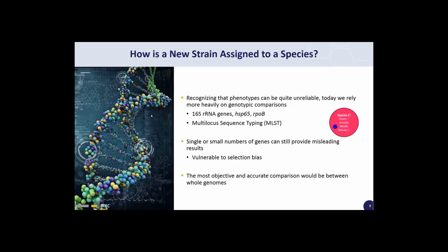If comparing this new nitrate-negative strain to the type strains we saw previously, it might be more tempting to categorize the new strain with a type strain that lacks a nitrate reduction pathway just because the observational endpoint for both is similar. This, of course, would be incorrect.